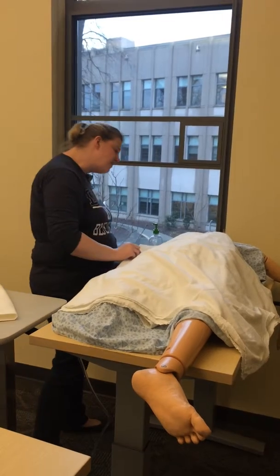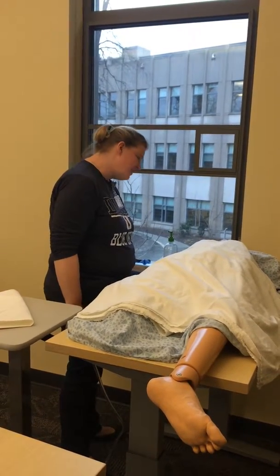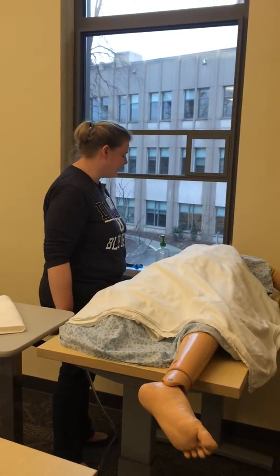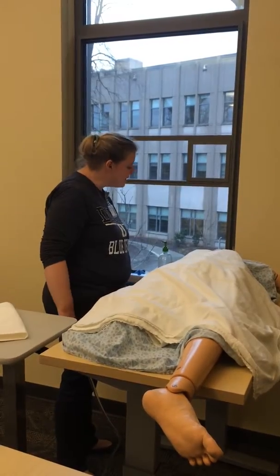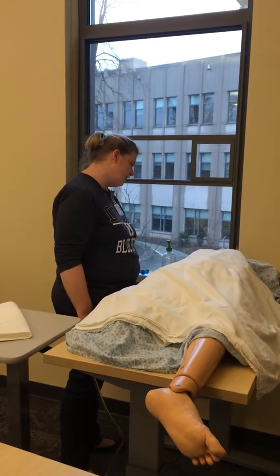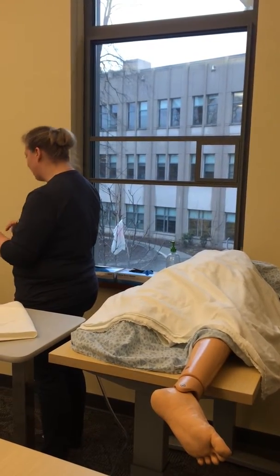Today we're going to take out your Foley catheter. Do you have any questions about it? Nope. Alright, well let me know if you have any pain or anything. I'm just going to go into the computer to check your MAR to make sure that you have an order to do this procedure. And she does have an order.